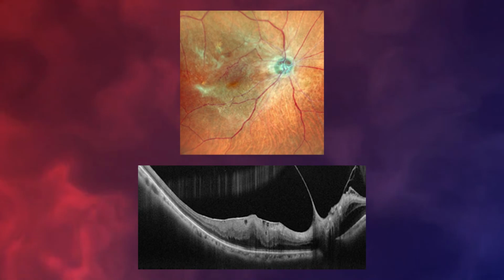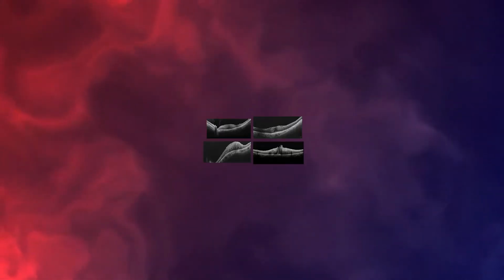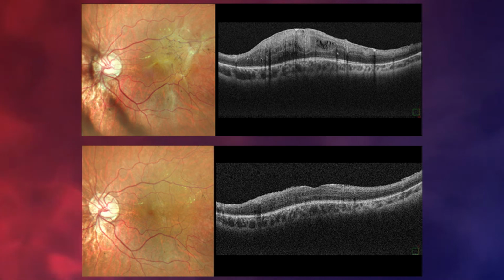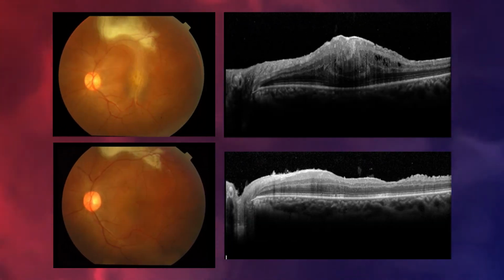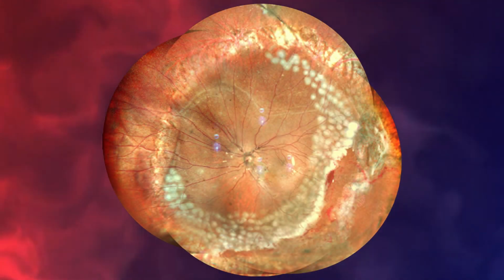Every case of epiretinal membrane comes with a different challenge, with factors like duration of the membrane, cause of membrane formation, and degree of traction affecting the visual outcomes. The right approach to a case of epiretinal membrane has a good success rate, with most patients experiencing improved visual acuity.